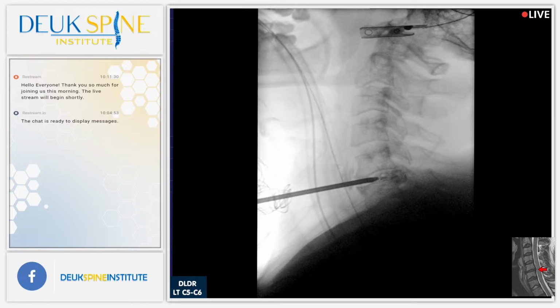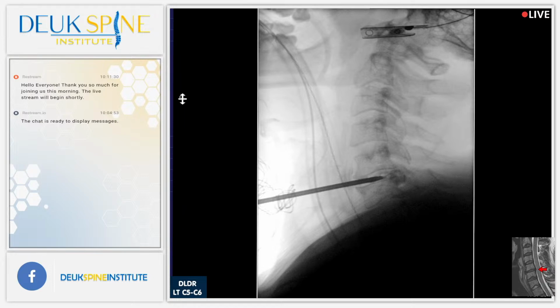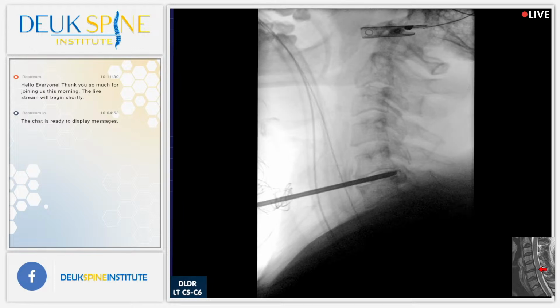Show us the herniation there, Jordan. Can you guys see the herniation there? Look how big it is. Yes, we can. Yeah, you can now see it because we put some dye around the herniation. So I'm going to gently advance this tip right to where the herniation is.